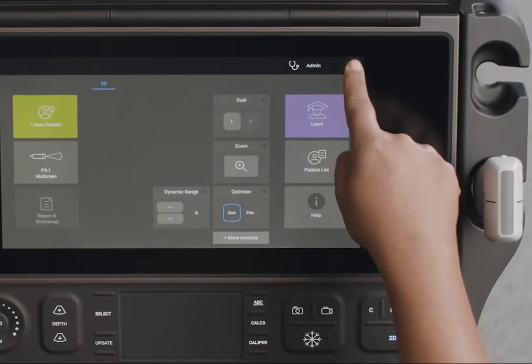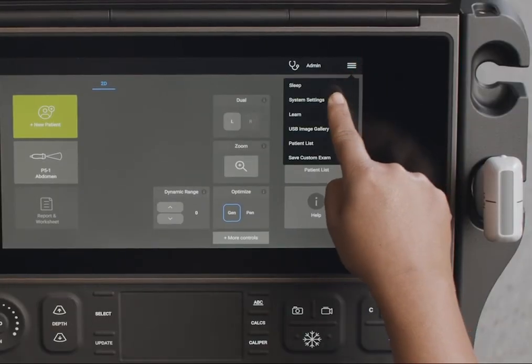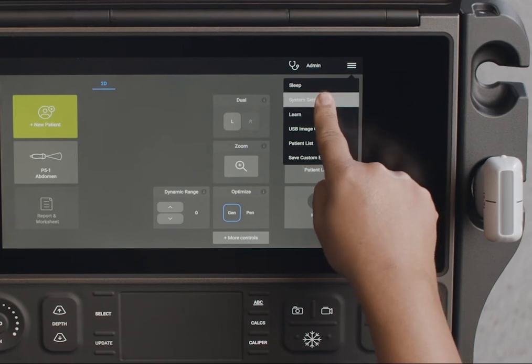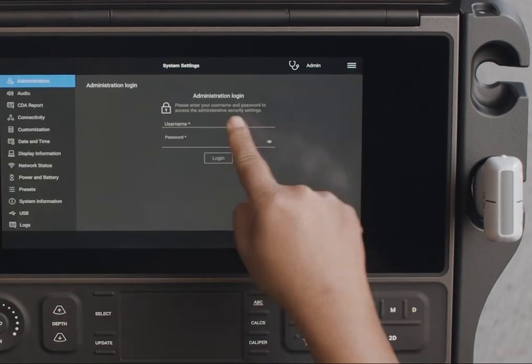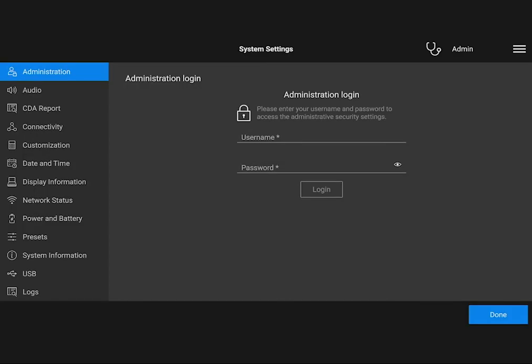To access the system settings, tap System Settings from the menu. From the Settings page, you can configure things like Sound, Calculations, Wireless and DICOM, and Display Settings.